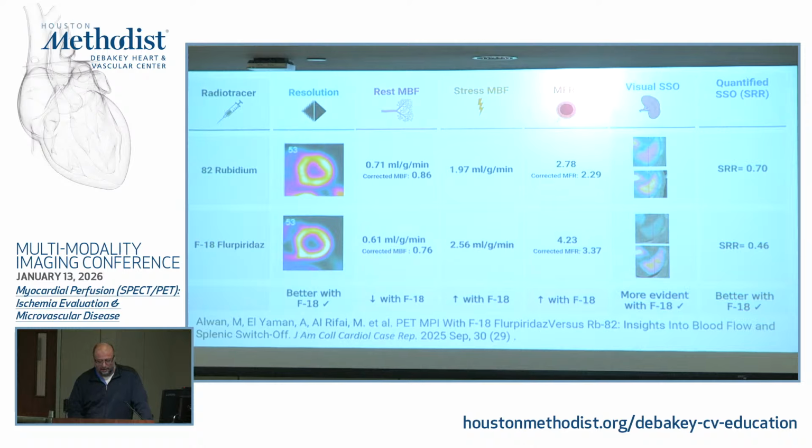Anyway, you can see it there. The spleen has some uptake, which gets less with the stress. So when you give regadenoson, the spleen has less blood flow. There is splanchnic vasoconstriction, so you get less gut uptake because hopefully the blood is being directed to the heart.